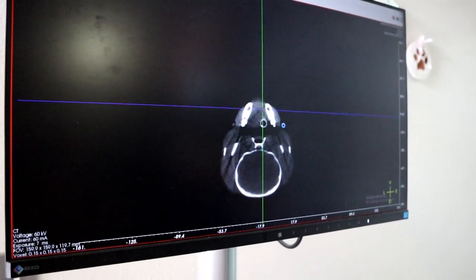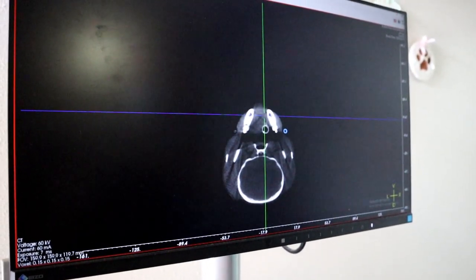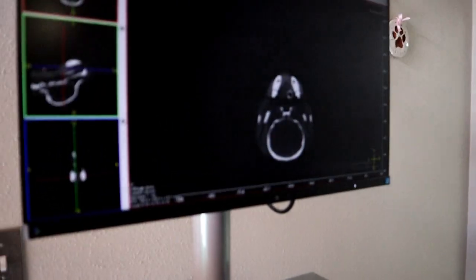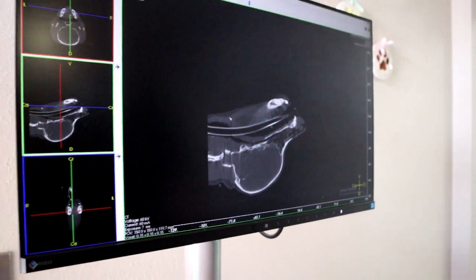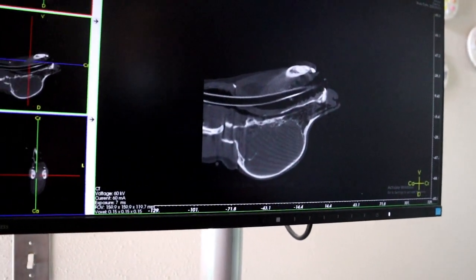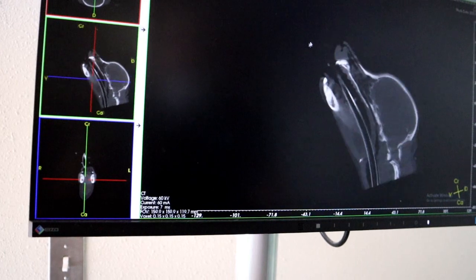Looking good so far. The computer's still thinking. Let's clear our image — we're going to full dynamic. There's the side view, so I'll just go ahead and rotate that into place.